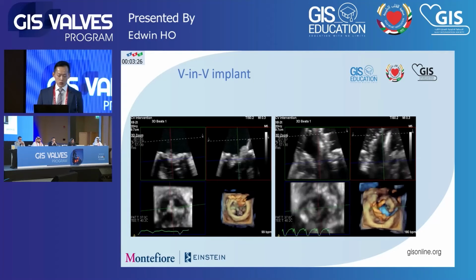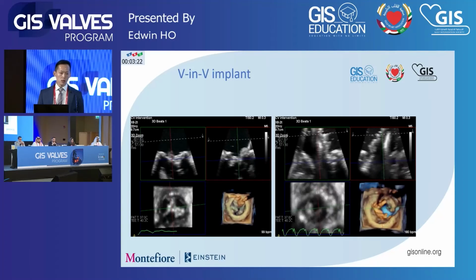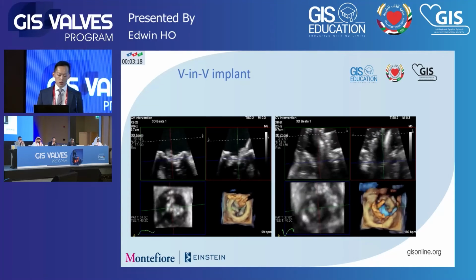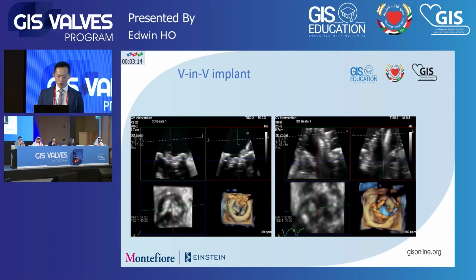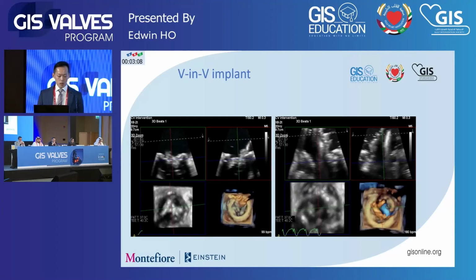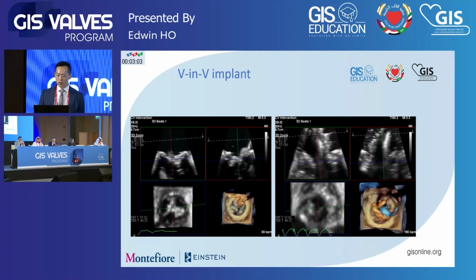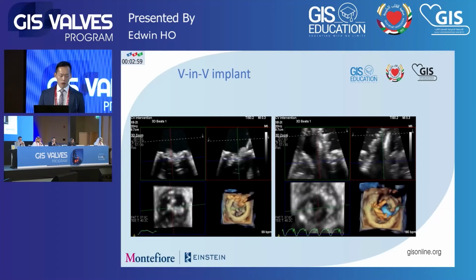Yesterday in the talk that I gave for tricuspid, I showed similar setup planes that we do for the tricuspid. The mitral is very similar, so we try to generate an en-face view, and then we'll generate cut planes that usually correspond with the intercommissural view and the long axis view through the LVOT. And then using 3D, and you can see here, using the newer probe, the X8 with Philips, we can get very good volume rates even though we're using live 3D, and the probe actually doesn't overheat even when you're using this for quite a period of time.